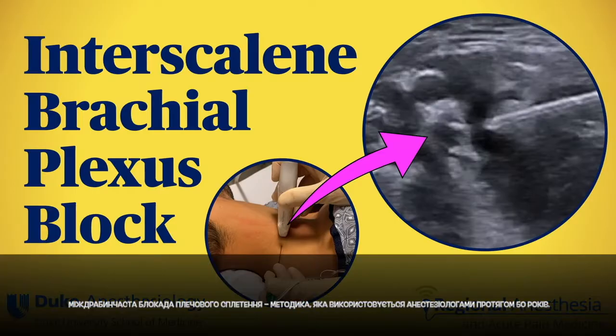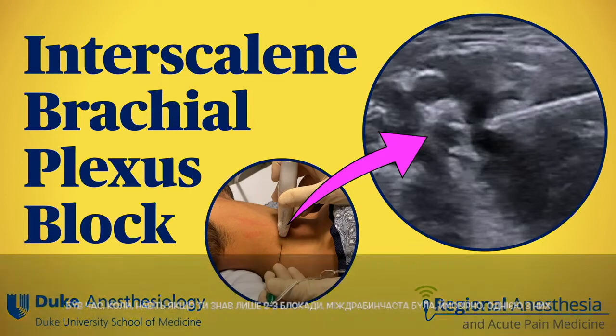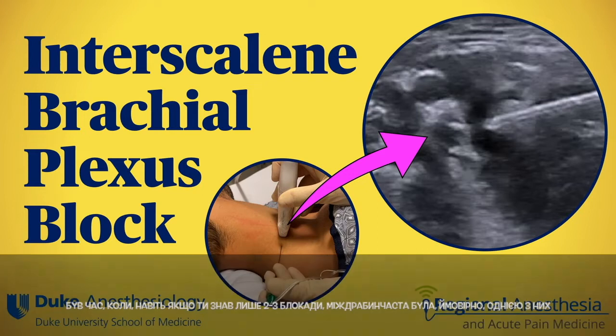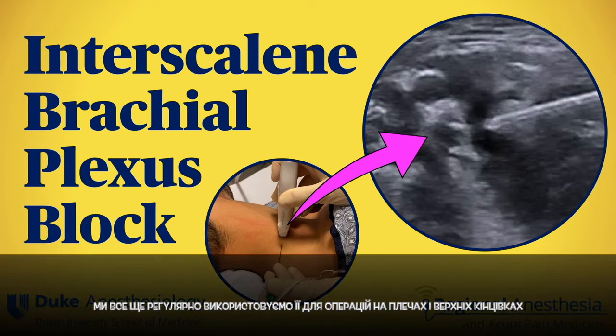The interscalene brachial plexus block is a technique that's been used by anesthesiologists for 50 years. There was a time when, even if you only knew 2 to 3 blocks, interscalene was probably one of them. We still use it routinely for shoulder and upper limb surgery, and in this video we'll discuss the technique and some key safety points to keep you out of trouble.